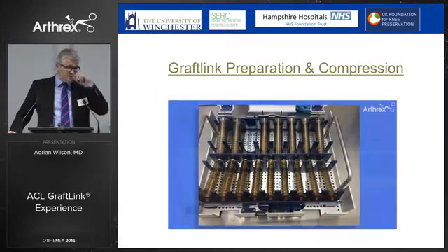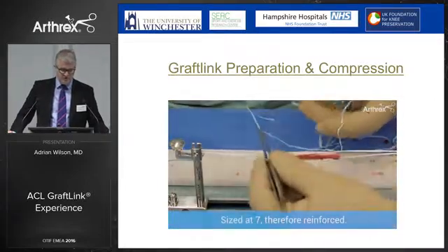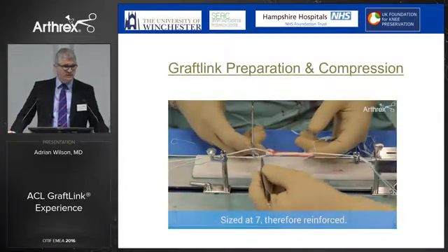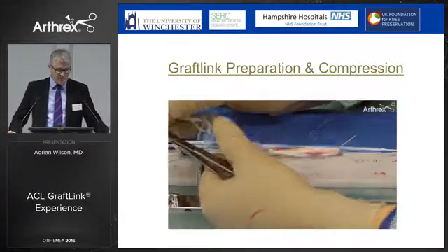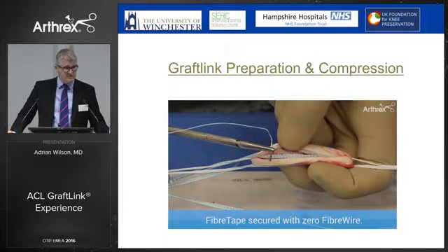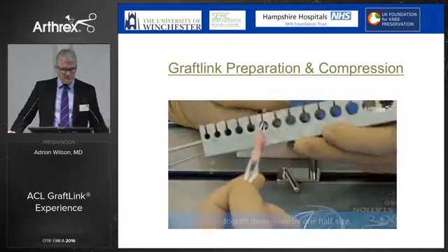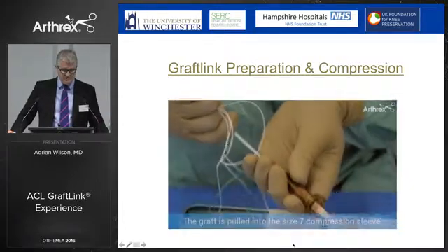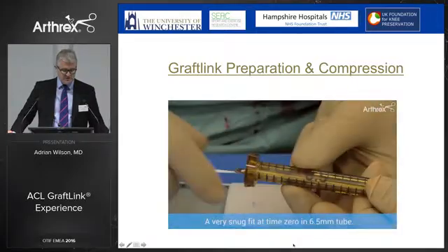So we came up with this concept a few years ago. These are two concepts that I'm going to show you in this short video. The first is reinforcement. Here, this is a small pediatric case. This is a very small graft, just 7 millimeters in diameter. And all I'm doing is laying some fiber tape into the middle of the graft, and we called that reinforcement. To marry up with Gordon's ideas and the internal brace, probably an easier concept now is to think of it as an internal brace augmentation to the procedure.